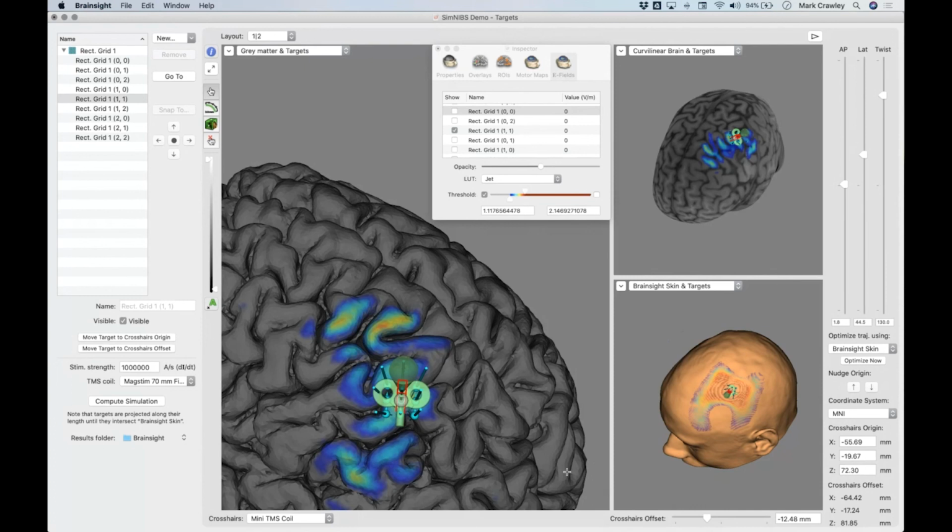That difference in how the CSF lies moves current a little bit differently, and there's a difference of between 5 and 10%. The paper's on the forum, so you can view it there, or if you want to get in touch with me, Mark at Brainbox-Neuro, I can send it to you directly as well. It's just a little bit of food for thought.